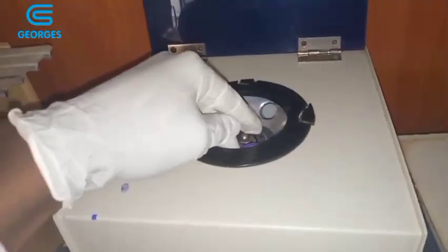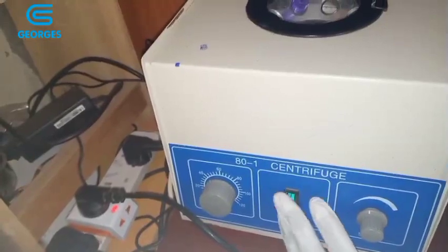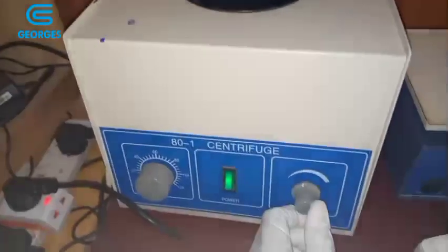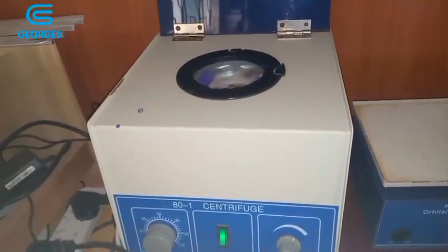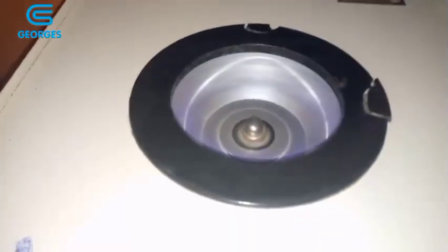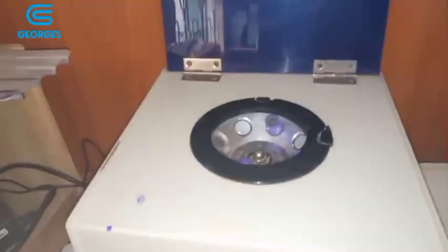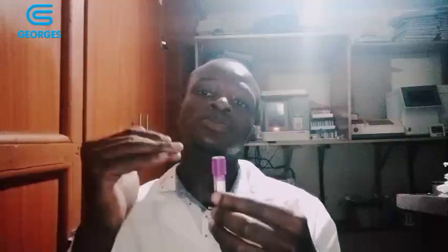So this can be determined by centrifugation. Actually, centrifugation is just rotation. We take the blood, we put it in a tube like this, and we rotate. We have a machine called a centrifuge. So the machine rotates the blood, and you find that the RBCs, since they are higher in density, will separate downwards, and the other component of whole blood, called the plasma, will be suspended on top of it. So we want to see the ratio of how much of the whole blood, the red blood cells, have separated to the lower compartment, and how much supernatant, the upper compartment, we have. So this is what we refer to as the hematocrit.